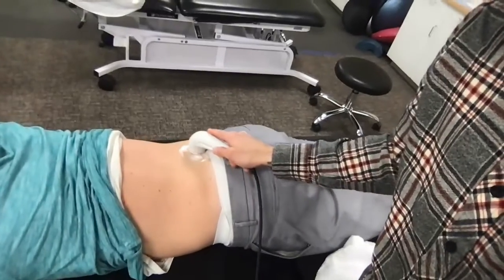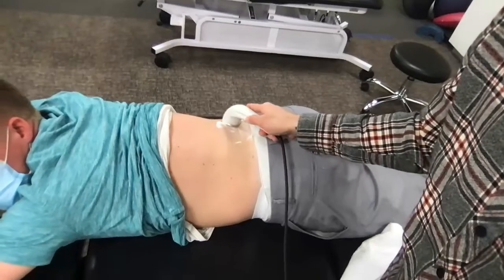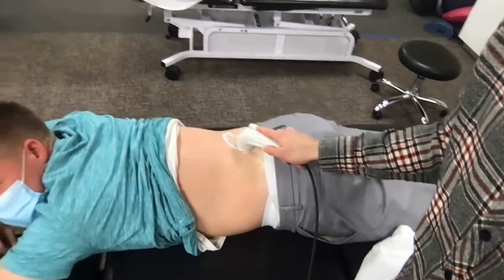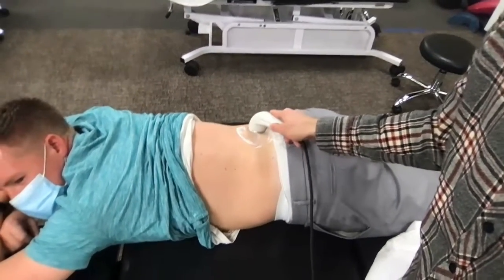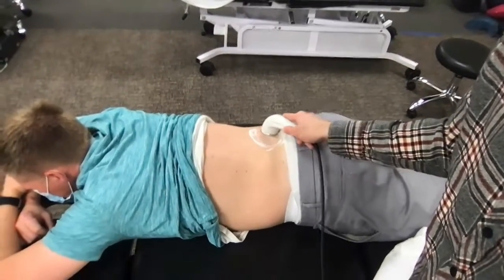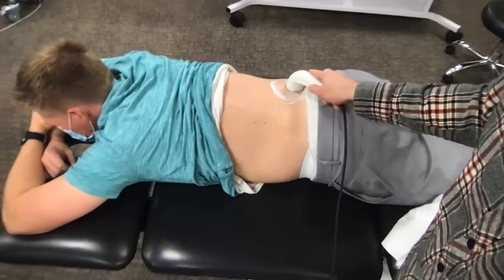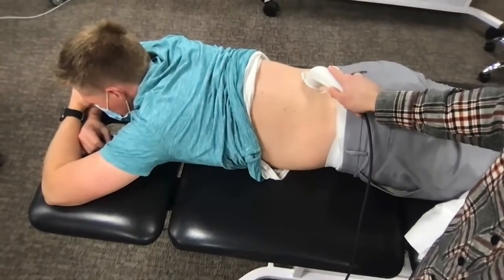Okay, so we just started the machine, and I'm going to move the head of the ultrasound in a circle, nice and slow, maintaining full contact with the skin, with an area of about 2 to 3 times the size of the effective radiating area, which is the size of the head.